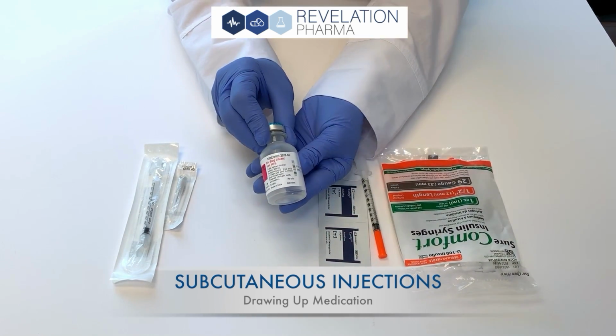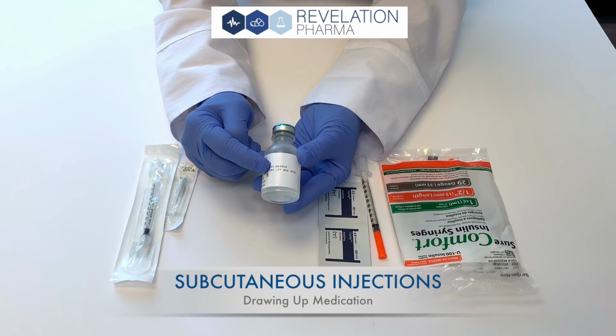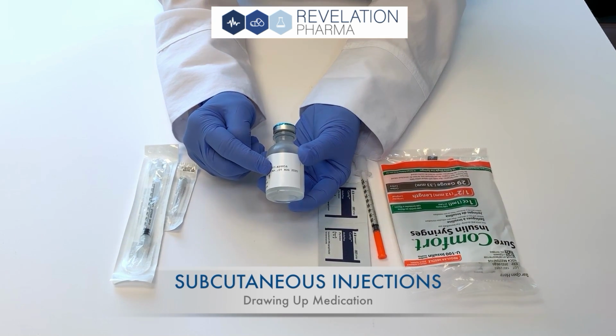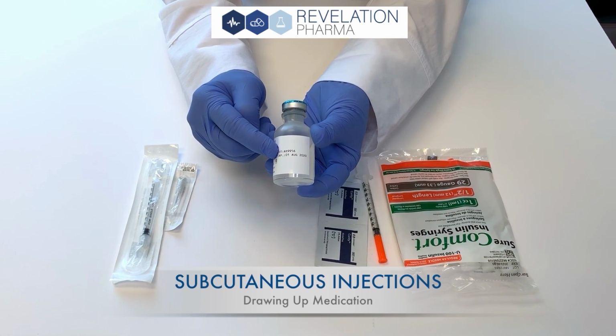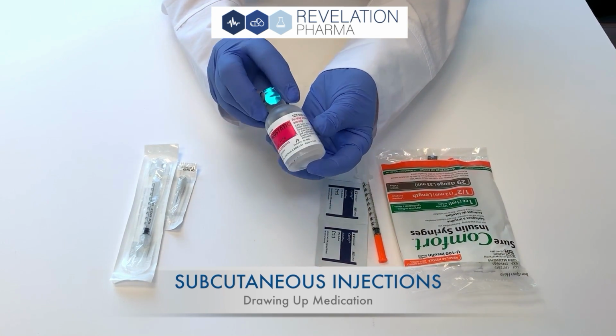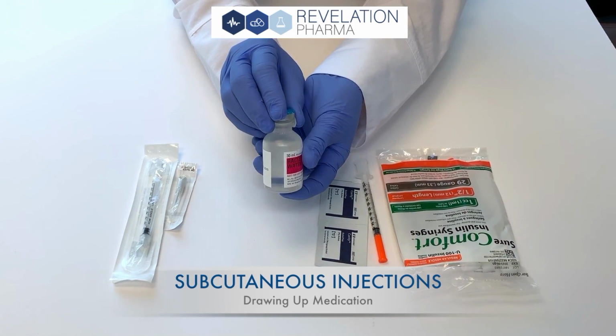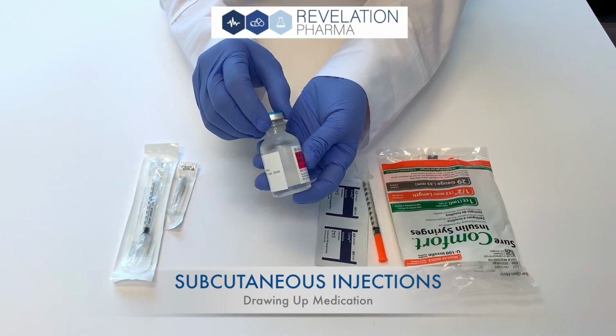Always make sure you check the beyond use date on your medication label. If today's date is beyond that date, or it has been 28 days since you first punctured the vial, you should give us a call for a refill. Also, check that the medication in the vial is not cloudy and contains no particulates.